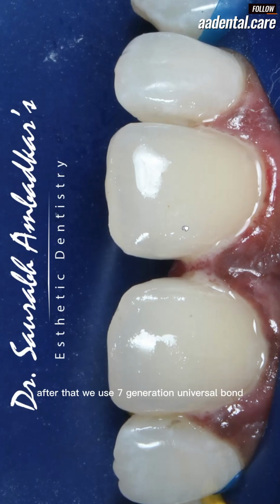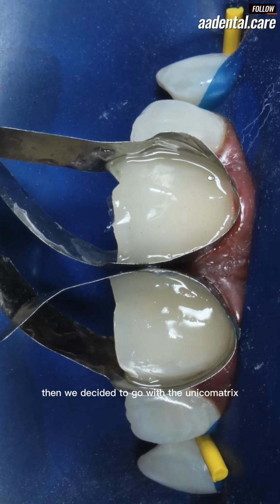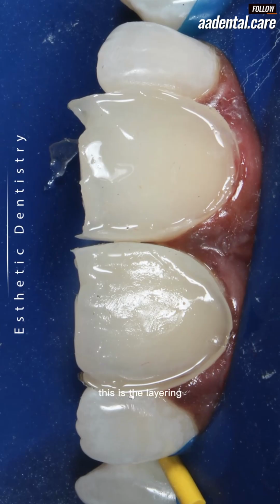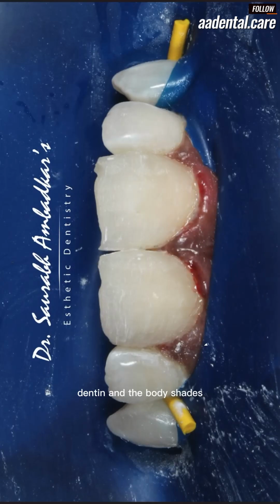After that, we used a 7th generation universal bond. You can see the bonding is done properly. Then we decided to go with the Unica matrix. These are the Unica matrices. This is the layering after the Unica matrices. I added all the layers like enamel, dentin and the body shades.